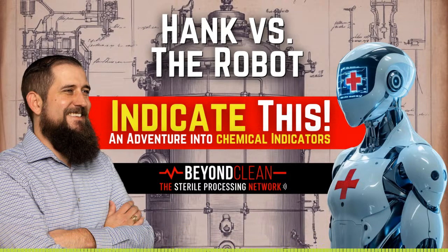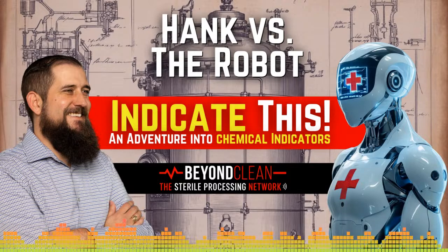Mechanical parametric monitoring. The sterilizer itself measures and logs key parameters like time, temperature, and pressure during the cycle. This data is crucial for ensuring the machine is working as designed. Strengths. Provides continuous objective data, helps diagnose machine issues or operator errors. Limitations. Can't verify conditions inside the load itself.